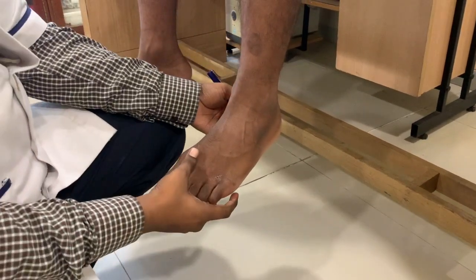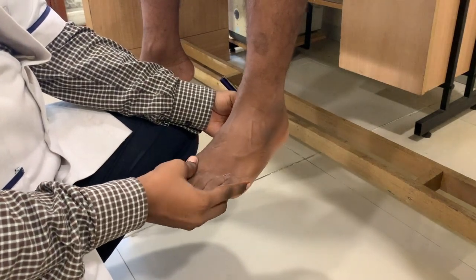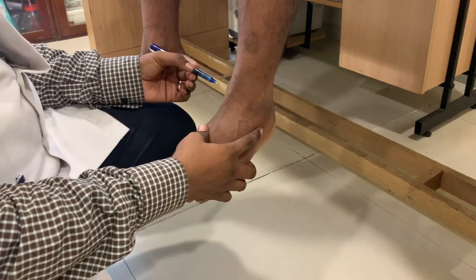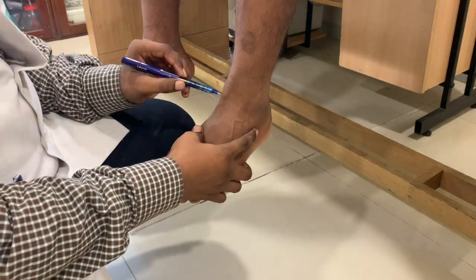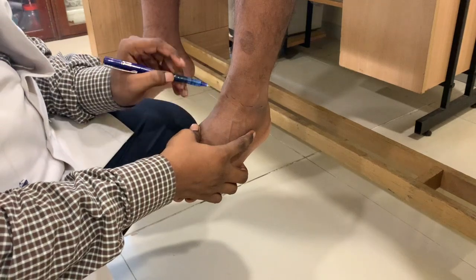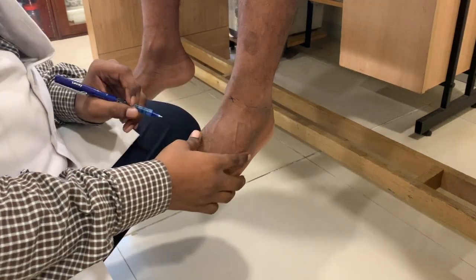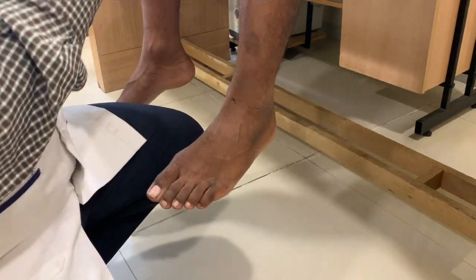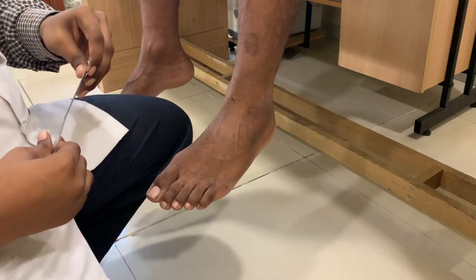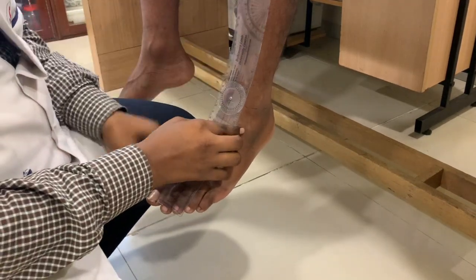Now to check the inversion and eversion range of motion, we have to draw an imaginary line between the two malleoli, and the center point of it is the fulcrum for inversion and eversion. So here you will keep the fulcrum at that point.